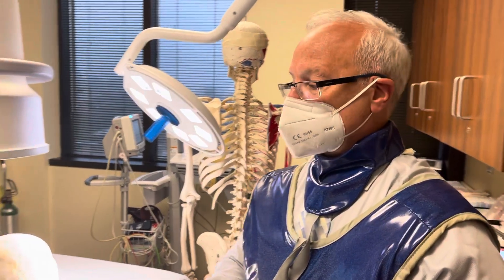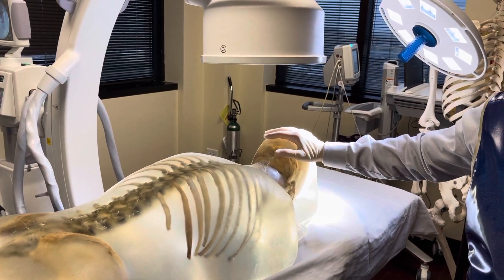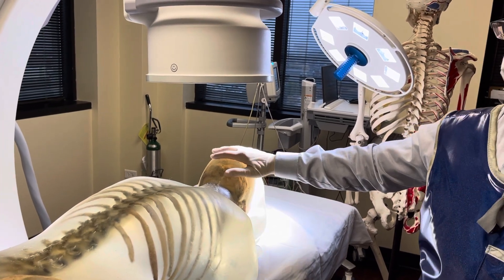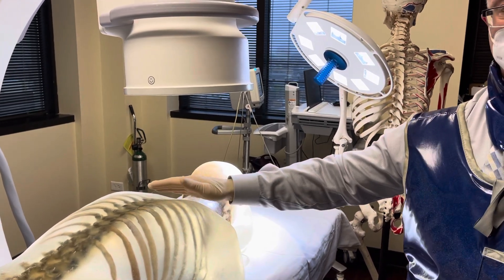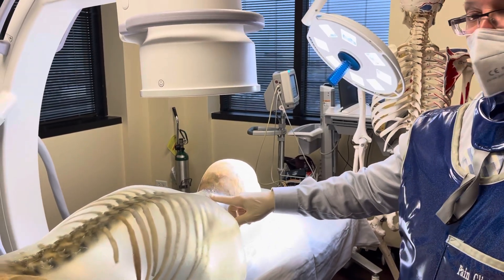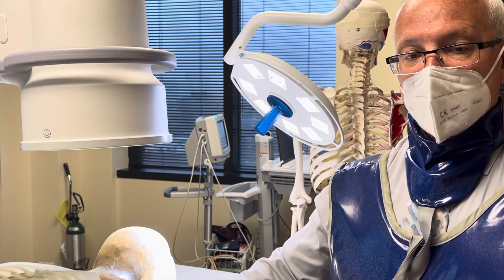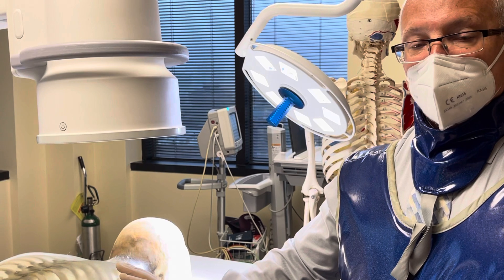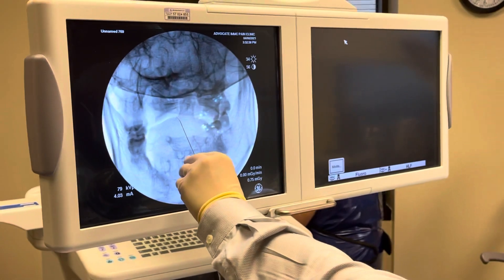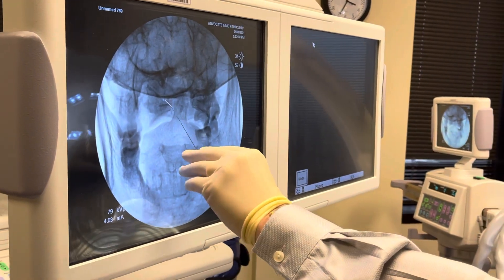I'm going to perform these techniques on a specimen in the prone position, arms at the side. A bolster is placed beneath the chest and the head and neck are gently flexed forward to patient satisfaction. After performing a sterile skin prep and drape, I anesthetize the appropriate anatomical locations using 1% lidocaine without epinephrine, typically two to four mls with a 27-gauge 1.5-inch needle. I then take a scout film, which clearly demonstrates the atlanto-axial joints and atlanto-occipital joints bilaterally.